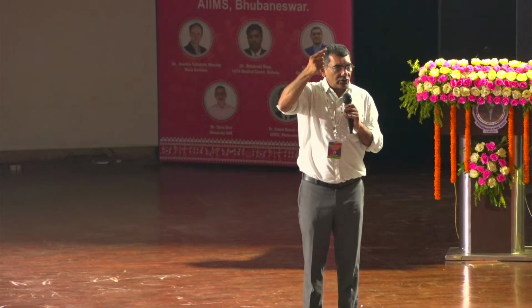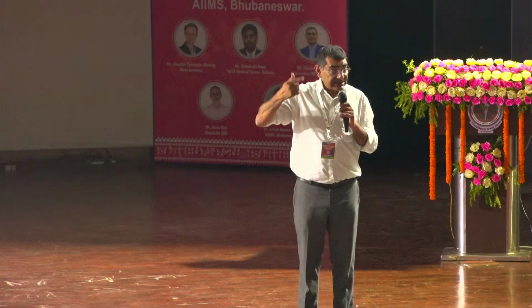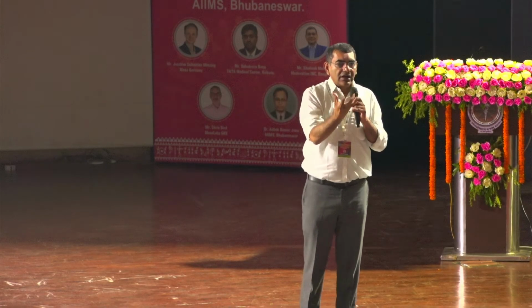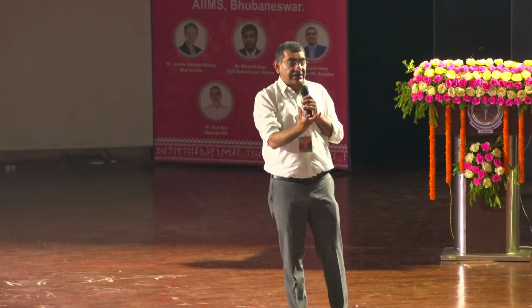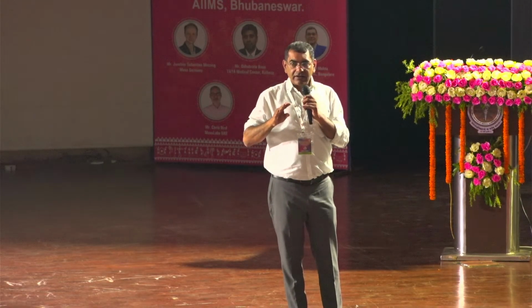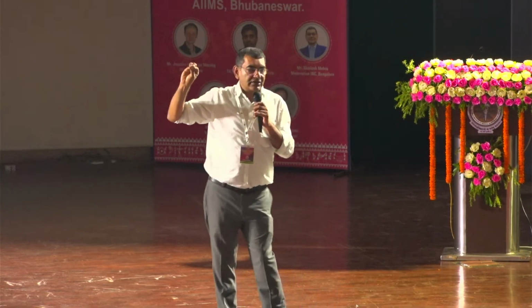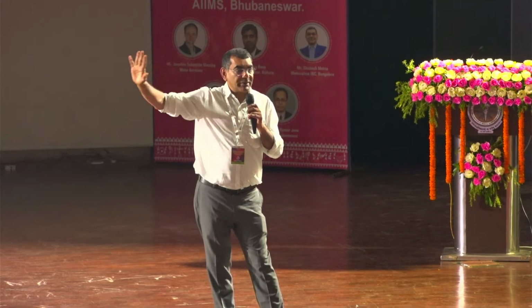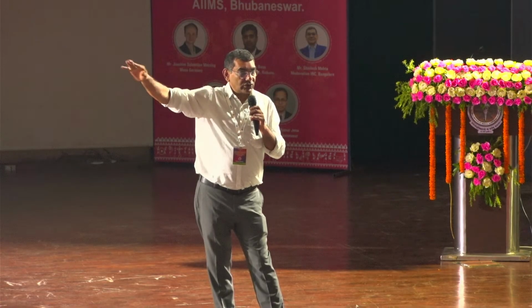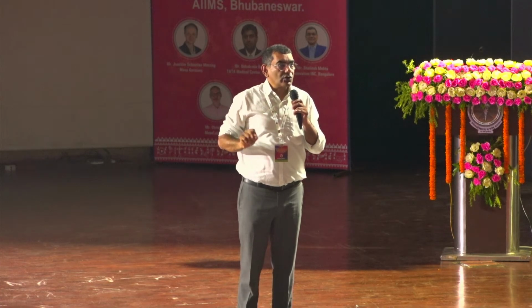So I want the spore to convert to germ. Germ, when it's converted, multiplication starts. Put it up gallipods. Now take some 10-15 gallipods. Put it on that. Pack it with the best wrapping. उसमें wrap कर दो. आपका सबसे बुरा एरिया कौन सा है? Maximum infection, OPD. Keep it there. 1, 2, 3, 4. पहला वाला माइक्रोबायोलॉजिस्ट को बोलना, he or she will send you 48 hours no growth.